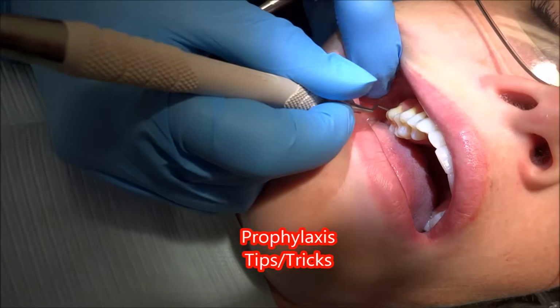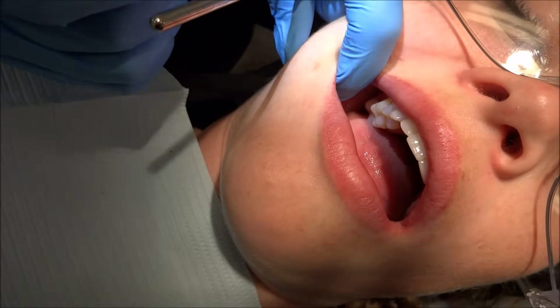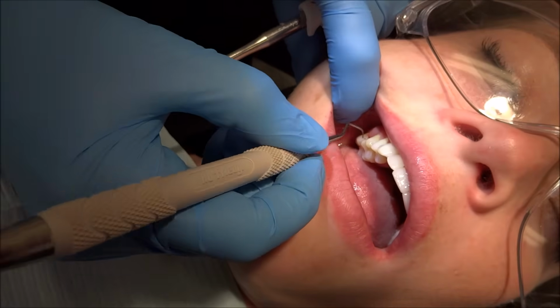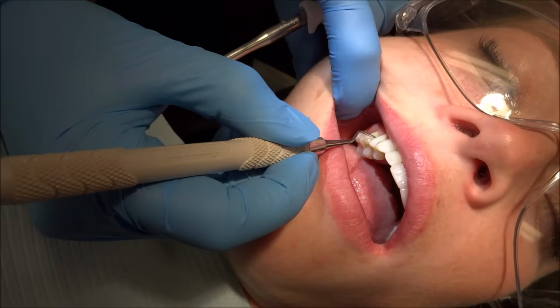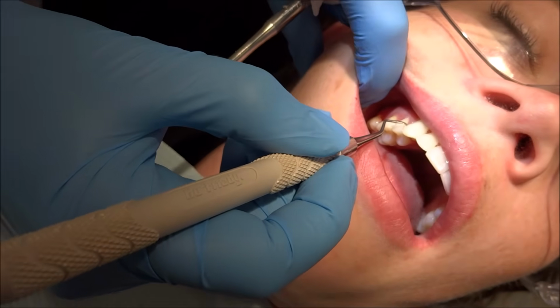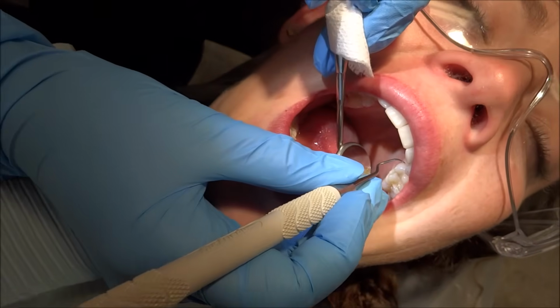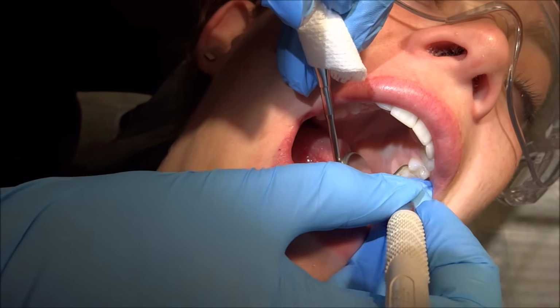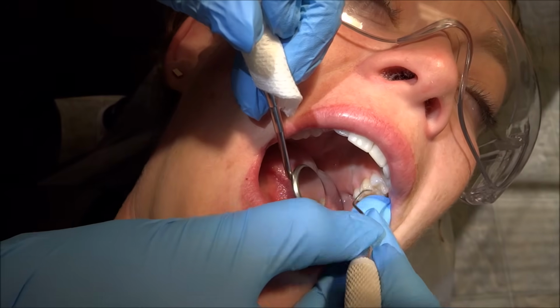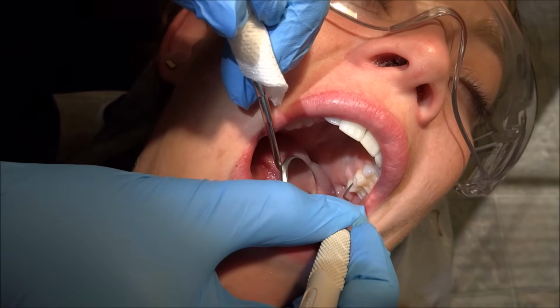I like to use an extra oral fulcrum, and I'll start on the molars. I have my gauze wrapped around my mirror if I need to wipe. Then I'll head over to the linguals. I like to use my mirror for a little extra illumination. Over here you can also use an extra oral fulcrum if you can't access those areas.